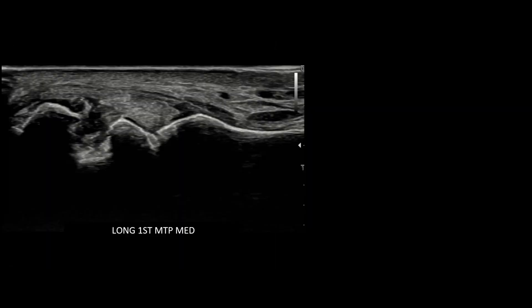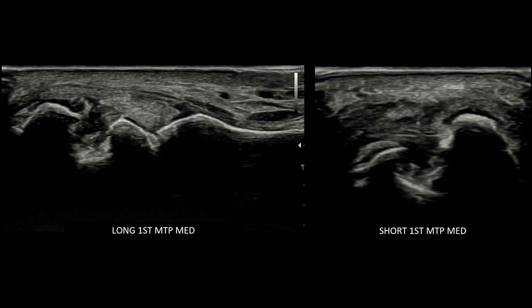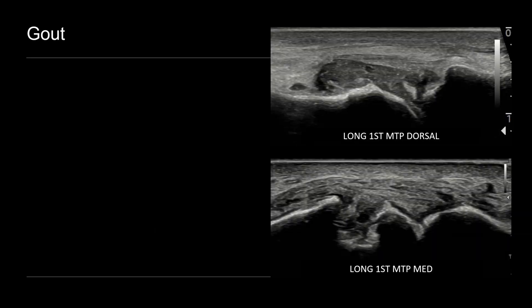When we move the transducer a bit more medially, again centered over the metatarsal phalangeal joint, we see a punched out erosion at the medial aspect of the first metatarsal head with some overlying synovial hypertrophy. Whenever you're suspecting an erosion on ultrasound, it's important to confirm this in two planes, as pseudoerosions — which are normal contour variations — can sometimes mimic erosions. When we turn to short axis on this area, we can see there is indeed another punched out erosion with overhanging edges and synovial hypertrophy. This is a typical ultrasound appearance for gout.